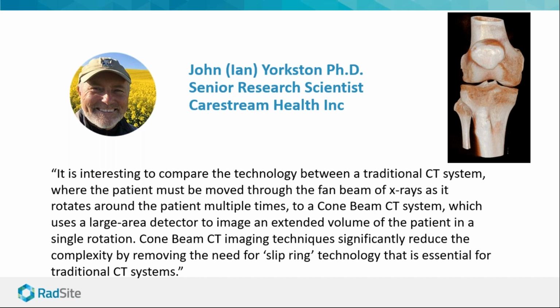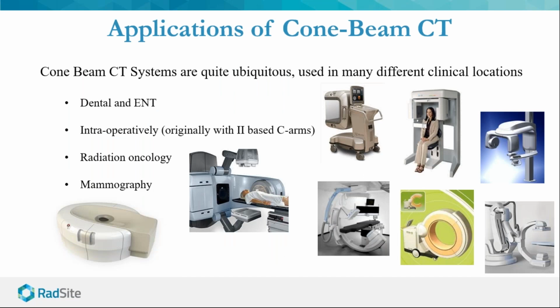And to start off, I would like to give a little bit of background about cone beam. These systems, although they're quite new, are quite ubiquitous, and they're already used in many different clinical locations. They first really hit the mainstream in the mid-90s to early 2000s in the field of dentistry and orthodontics, where now they are standard of care.